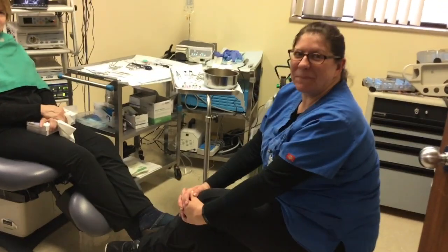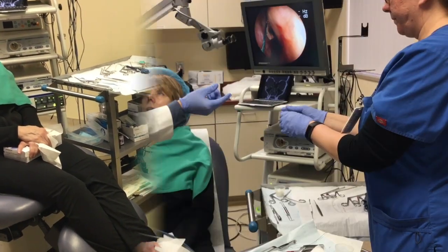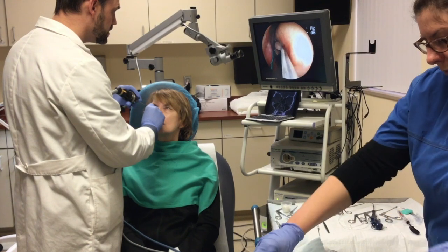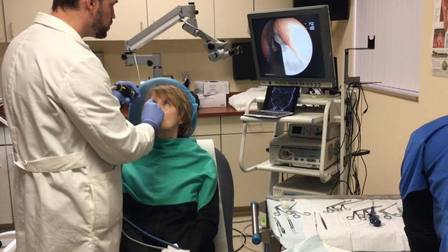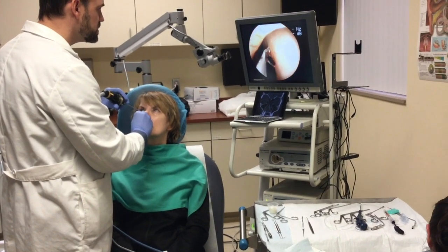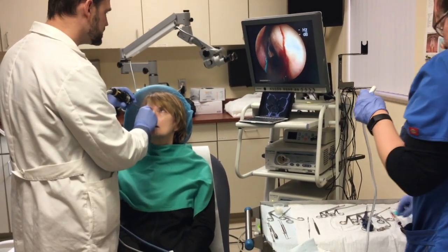So tell me, did this help you? Yes. I can breathe through my nose, and my colds are not as bad. Okay, good. Your septum here should be completely numb. I'm just going to test it, and you just tell me if you feel pain or pressure here. Anything there? It's not hurting. A little pressure? Yes. I'll just make a small incision in front of where the bulges. There's not a lot of bleeding because your body regulates something like this.